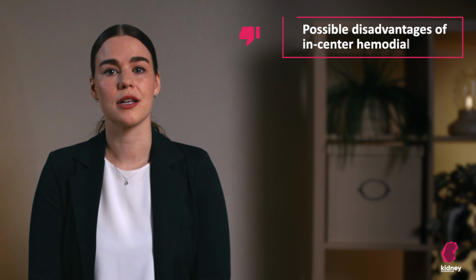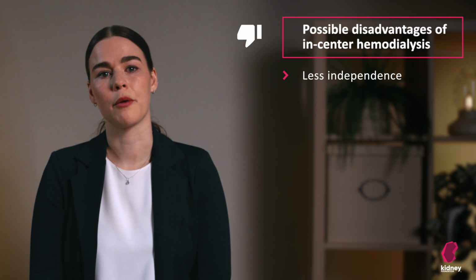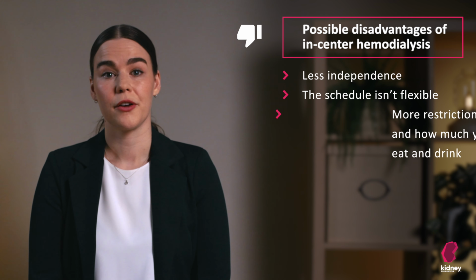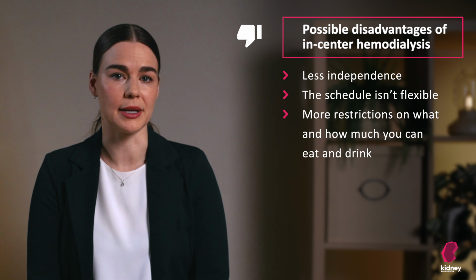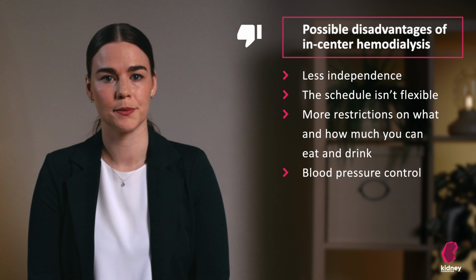Possible disadvantages of in-center hemodialysis. There is less independence than with home dialysis, and the schedule isn't very flexible. There are more restrictions on what and how much you can eat and drink. The amount of fluid you can drink is limited. High blood pressure can be more difficult to control.